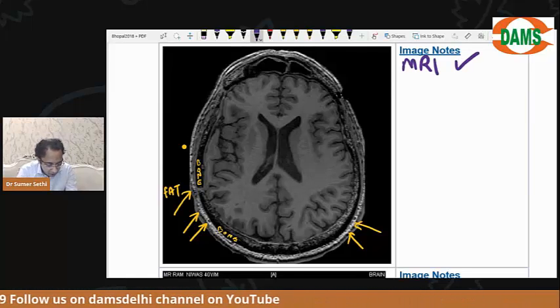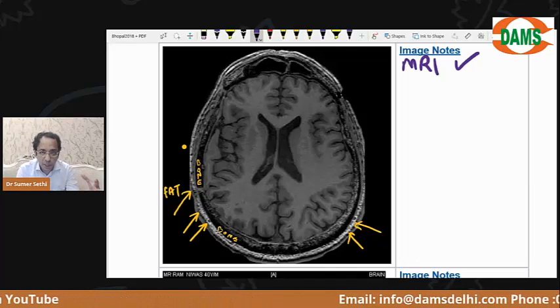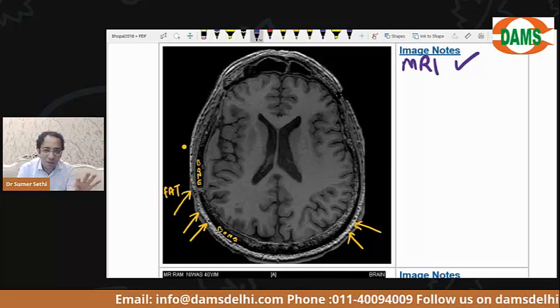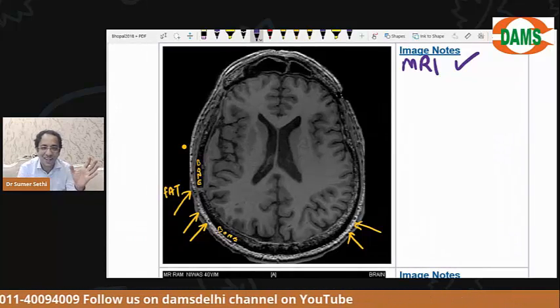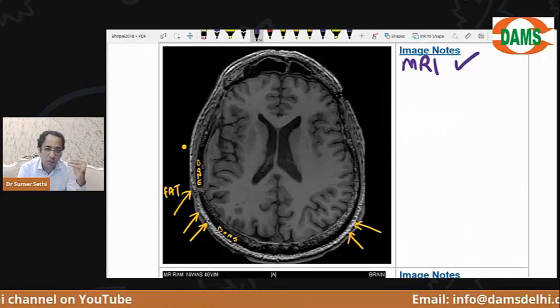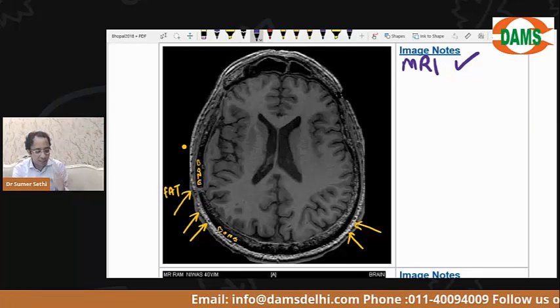Children, I hope you see that. You people want to become PhD, but I want to make you first MBBS students. For MBBS students in the exam, the most common mistake in radiology is not knowing whether it is CT or MRI, sir, that is what you haven't understood. So don't rush too much. Let me build up. I will go to the level where you will be able to see tumors also. But let us go step by step.